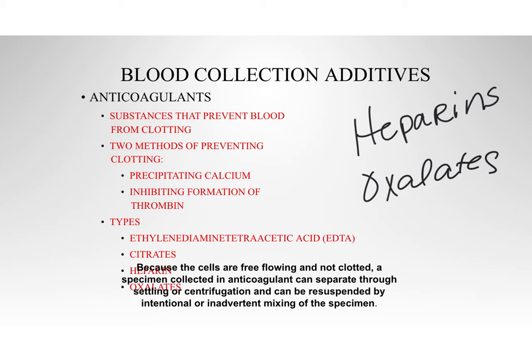So what that's saying is when we have a whole blood specimen, it is exactly like it's flowing through your veins, because there's an anticoagulant inside that tube that keeps it from clotting. Well, gravity takes hold and those formed elements sink to the bottom of that tube. So before we test the blood, we would mix that tube for up to 2 minutes before we run any tests on it, to make sure it is looking again like it's free flowing through our bloodstream, okay?